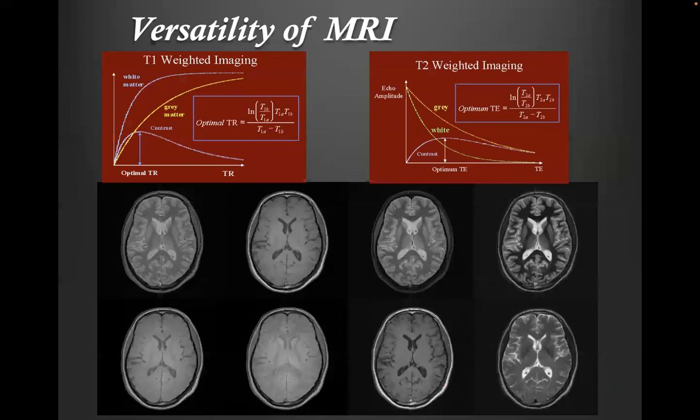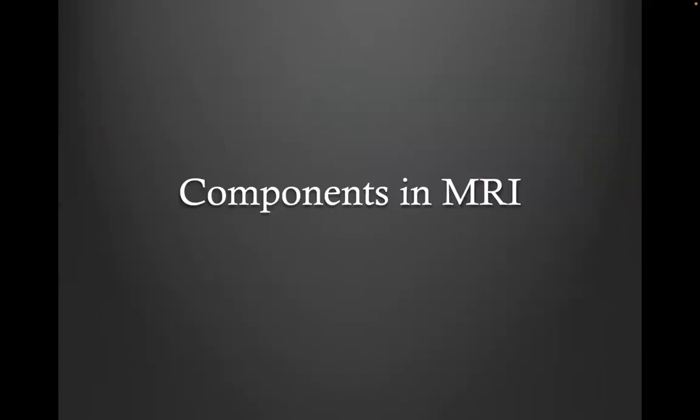And of course, in MRI, the beauty of MRI is you have a lot of signal contrast to play with, right? So you have T1 weighting, T2 weighting, and you can make a whole range of imaging contrast within there, which is shown in the little graph here. And again, we're not going to go into the details, but just know that by manipulating your imaging weightings, you can get all kinds of different contrast.